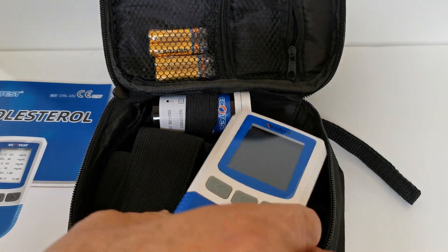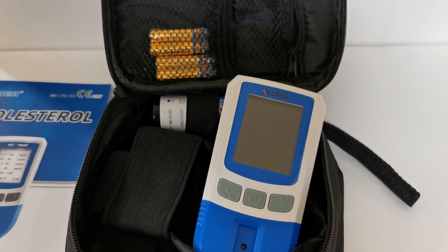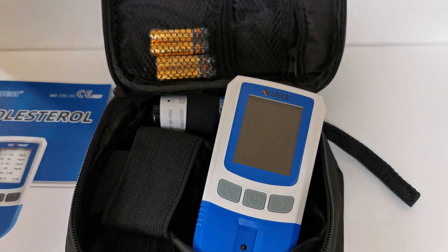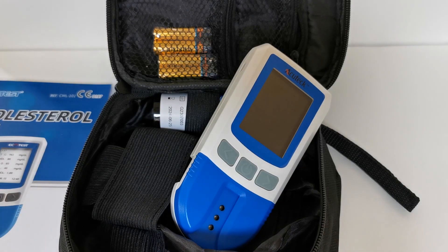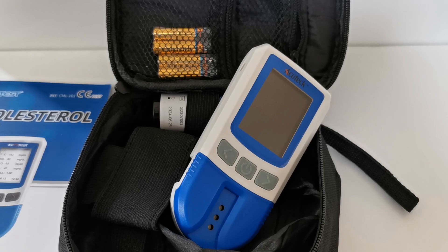In the next section, we're going to pop the batteries into the meter and show you how to set the time and date. That way, when you come to do your first test, the memory — which holds up to a thousand results — will also record the time and date when those tests were performed.